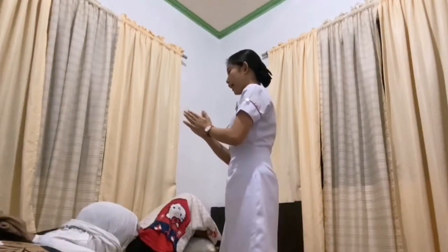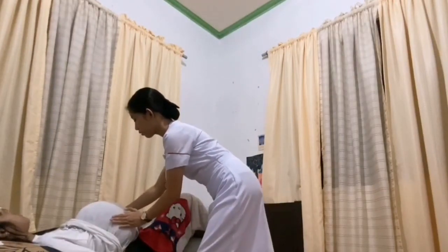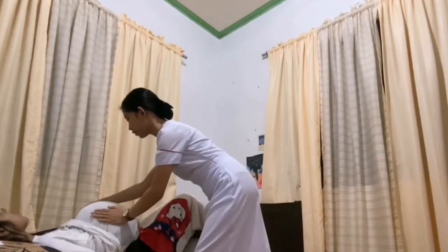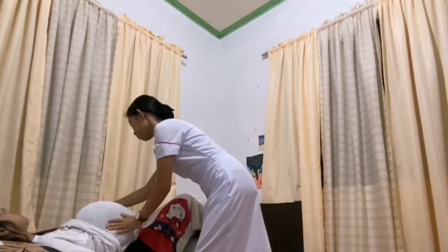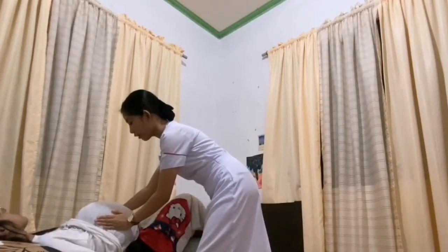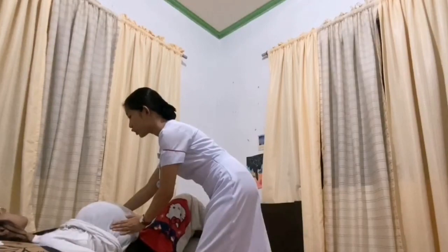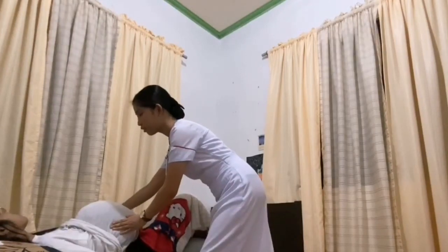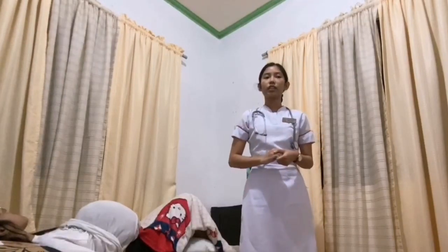So ma'am, I'll be palpating again po. So on the left side, I feel the hard structure, so I assume that this is the back of the fetus, while on the right side is the softer one, so I assume that this is the extremities. After that is the third maneuver or the Pawlik's grip.